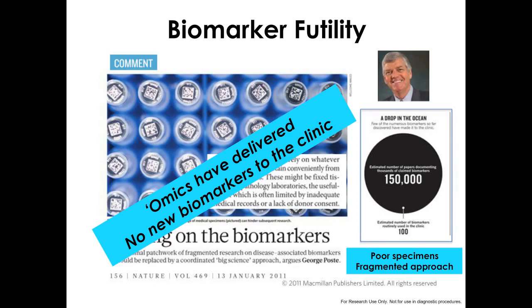And George Post identified what he thought were a number of reasons as to why that's the case, including the fact that we were using or have been using poor specimens, that we've had a fragmented approach to the way that we do this. So I'm getting a little carried away with the animations there.